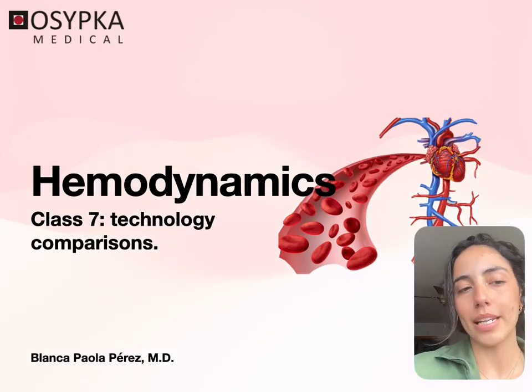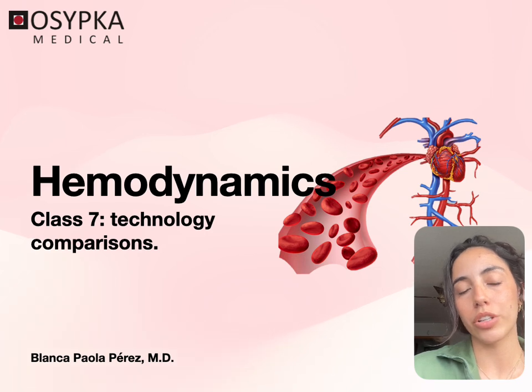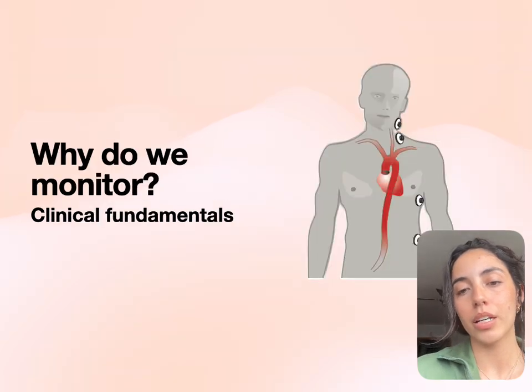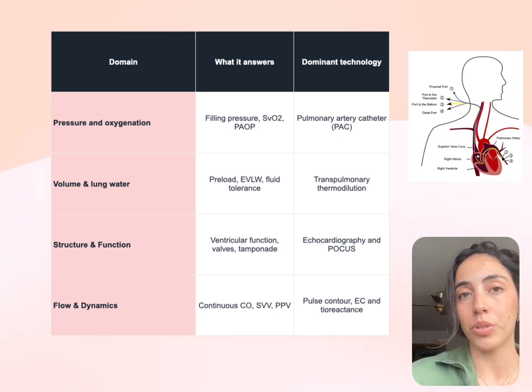Everyone, and welcome to today's class on hemodynamics. We're going to be going through the different technology comparisons of available monitoring techniques within the market. The first central question is, why do we monitor? So we rely on the clinical status of a patient to understand how they're doing hemodynamically.